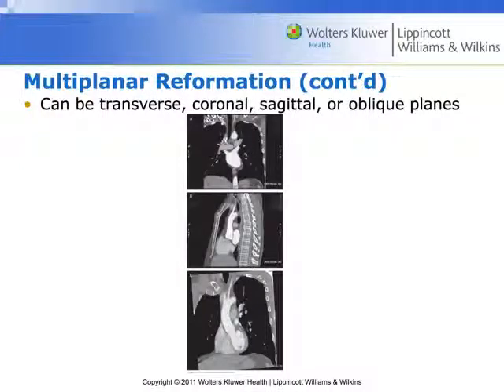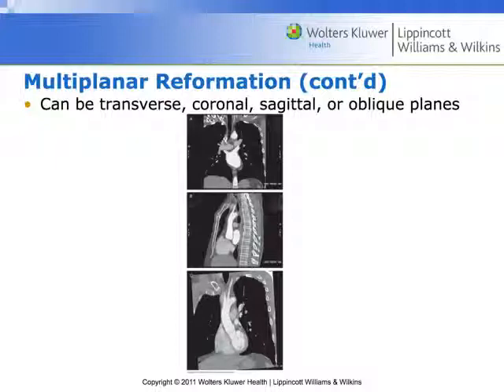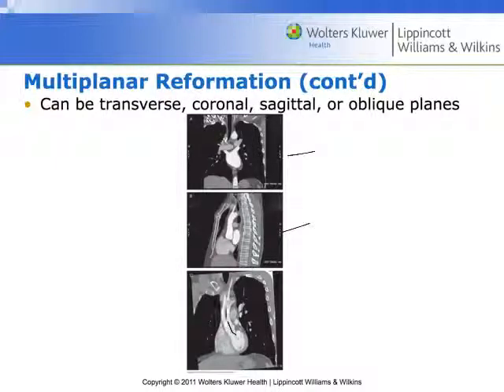Here are some examples of multi-planar reformats. In particular, these look like they're imaging the aorta or maybe the heart. This view here is coronal, this one is sagittal, and this is an oblique view that allows us very nicely to see almost the entire aortic arch.